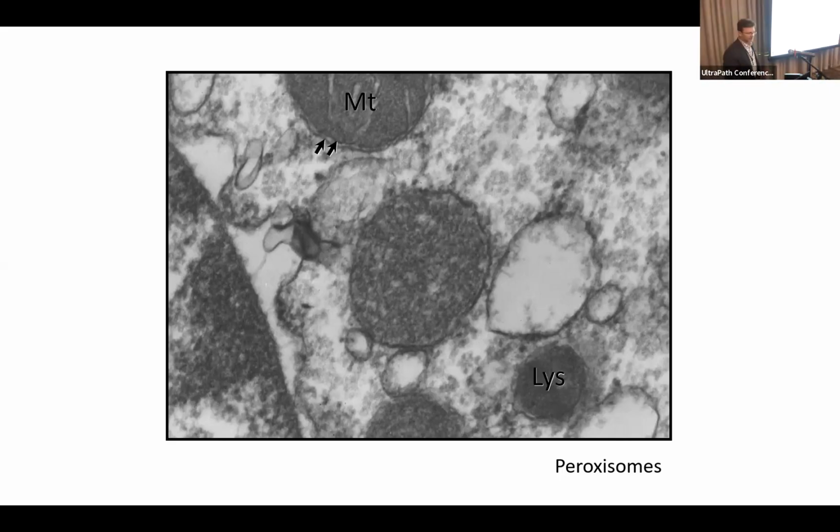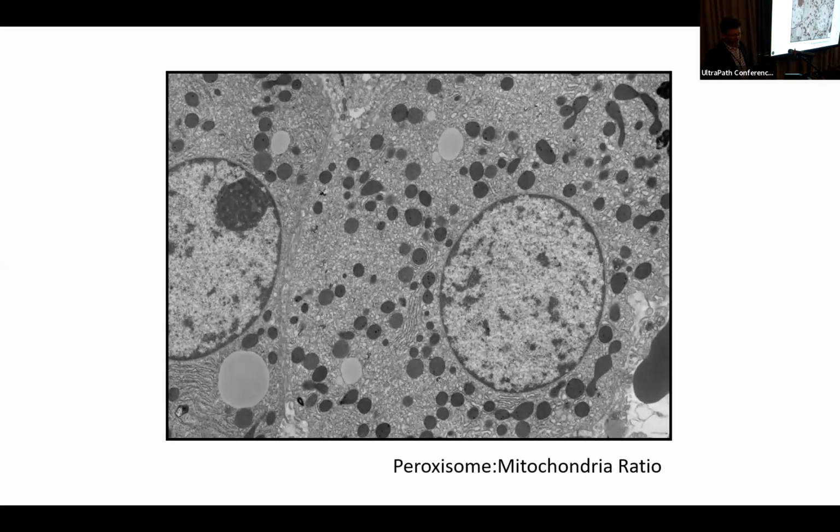And so being able to discriminate them from the mitochondria, which are similar in appearance, and also from primary lysosomes, which you can see, a primary lysosome down in that lower corner. The peroxisomes tend to be a little bit more flocculent or mottled in appearance like that, and usually a little bit larger than lysosomes, but lysosome variability is pretty great. So you can't always rely on that.